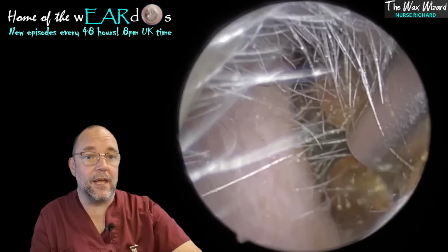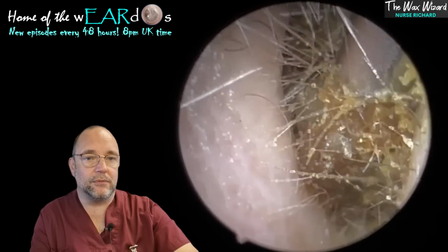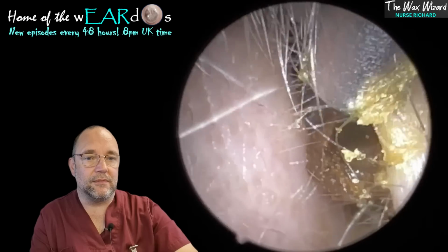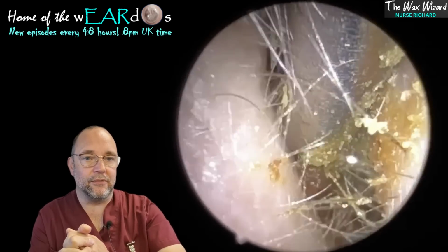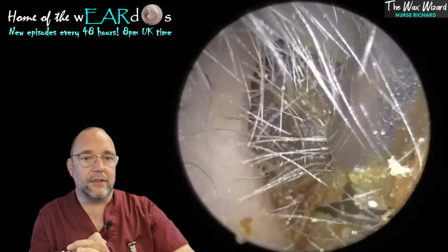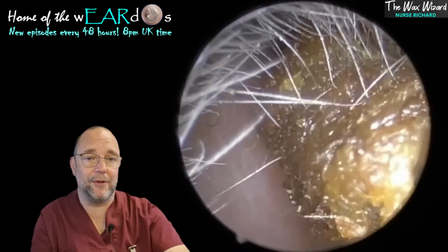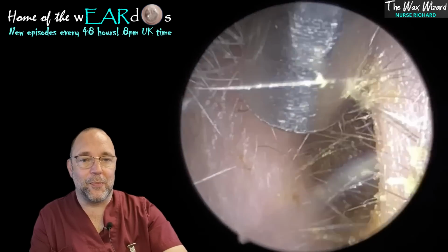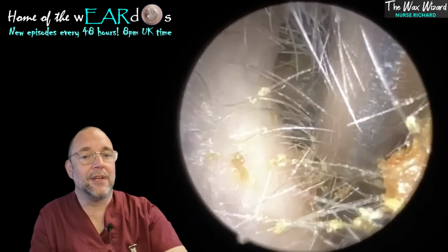And the same thing happens every single time, where you have a look at this and you think, well, that's not too difficult. Bit of dark wax there, and comes out relatively straightforward. But then he gets this thick layer of dead skin that's failed to migrate out of the ear. But the bigger problem is it gets stuck onto his eardrum every single time, and it's so difficult to remove. When I see his name pop up, I'm not going to lie, my heart sinks a little bit. He's a nice fella, don't get me wrong, but his ear is always very difficult to do. You'll see why in a minute.